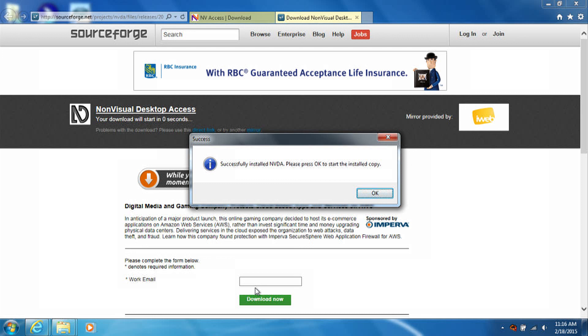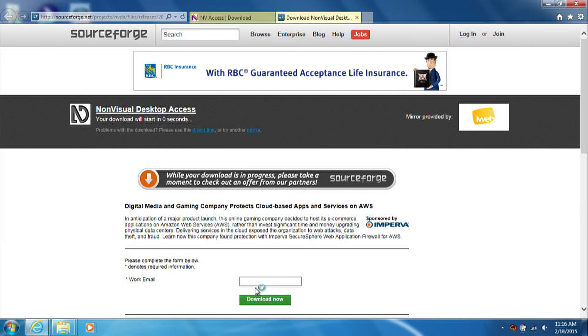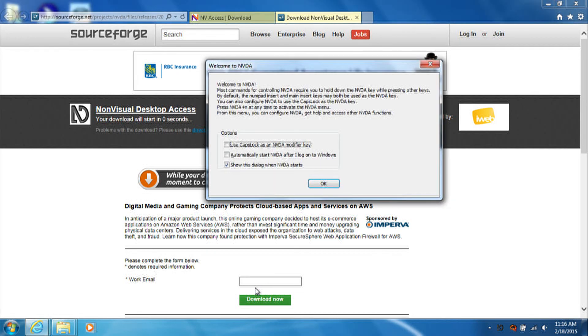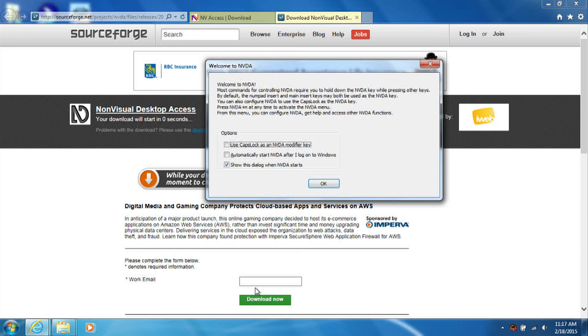Installing NVDA dialog. Success dialog. Successfully installed NVDA. Please press OK to start the installed copy. Once the NVDA install completes, you will be presented with a screen which asks you to press OK to start the installed copy. You can either click the OK button, or just press Enter.